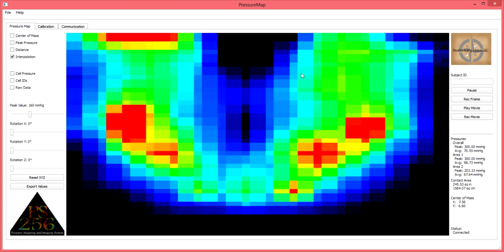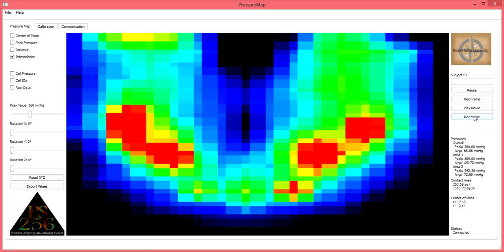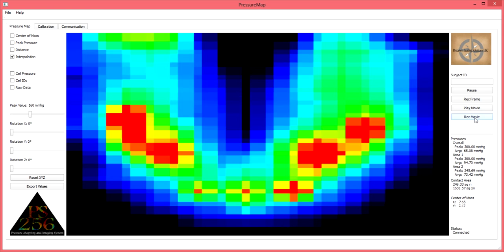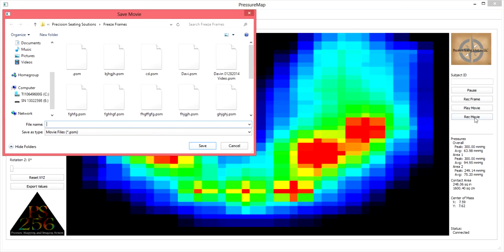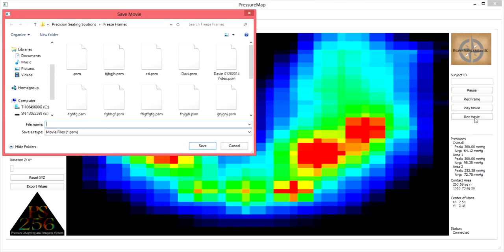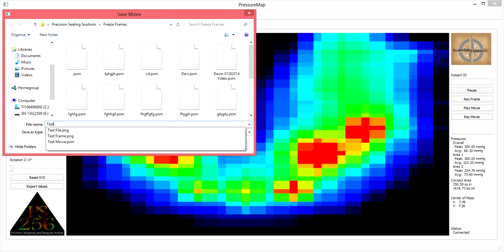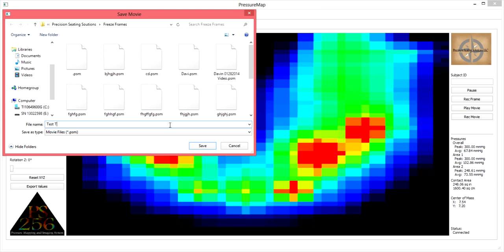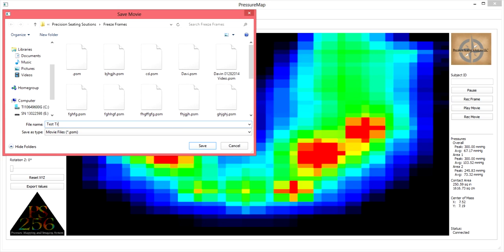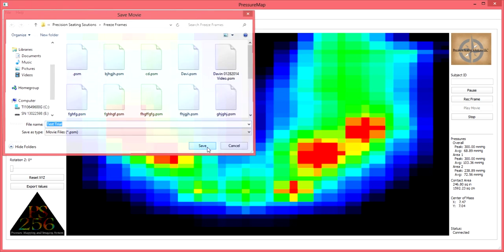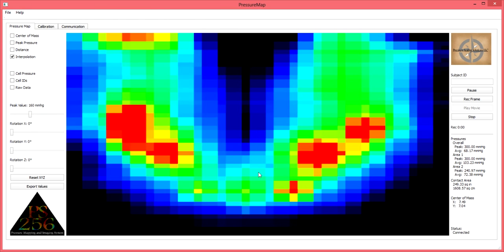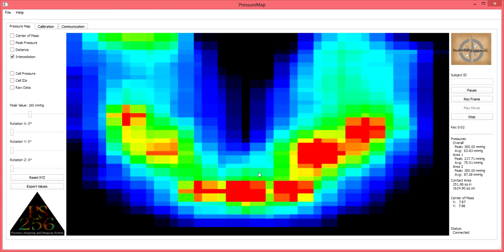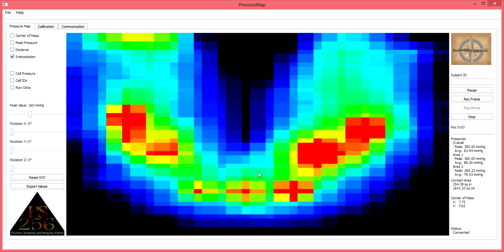Now, to record a movie, same concept, you'll click on the record movie button over here on the right-hand side of the software screen, and again, it will ask you where you would like to save the movie which is about to be recorded. Provide it with a name, click on save, and as soon as you click on save, the recording process will begin.